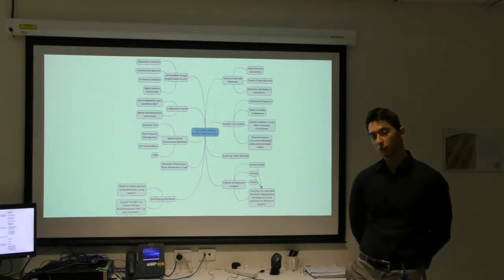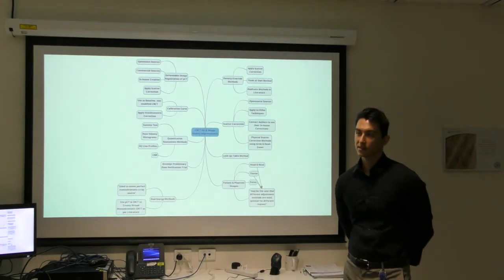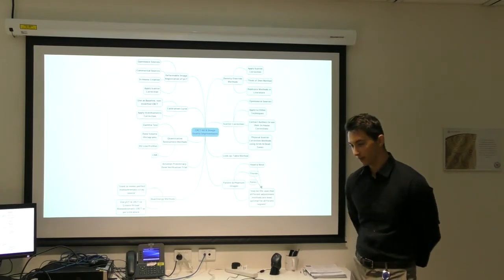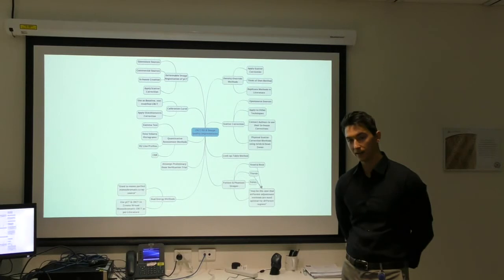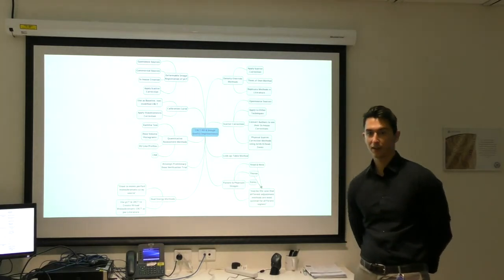I know CBCTs weren't initially designed to be used for adaptive radiotherapy, but they do show a lot of promise, at least in certain anatomical regions. I think a result from my research would be that it's probably not applicable for all regions, or different correction methods are better for certain regions than others, and that's valuable information that I have not been able to find in the literature thus far.